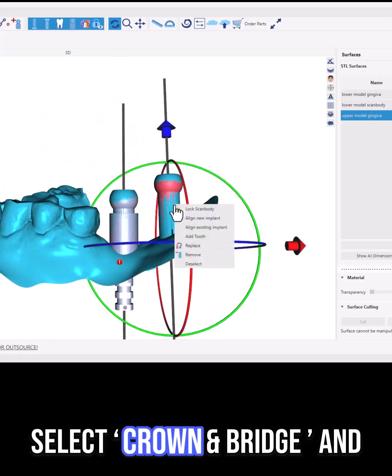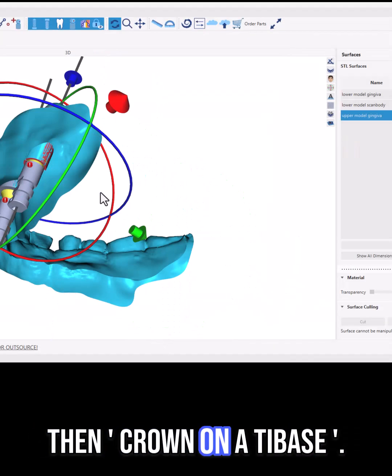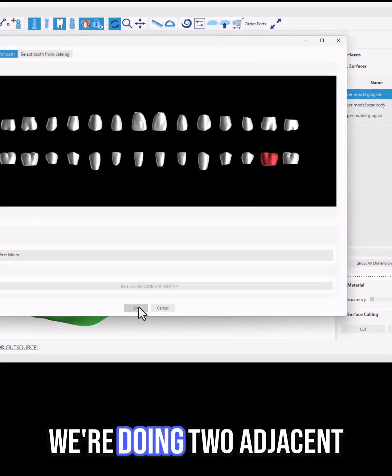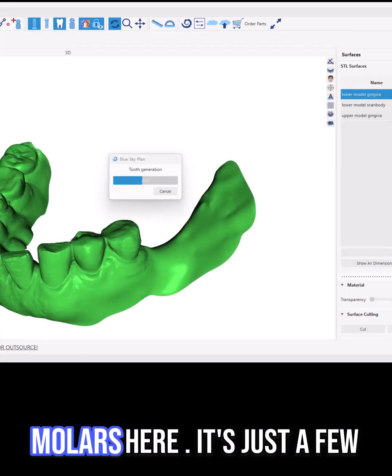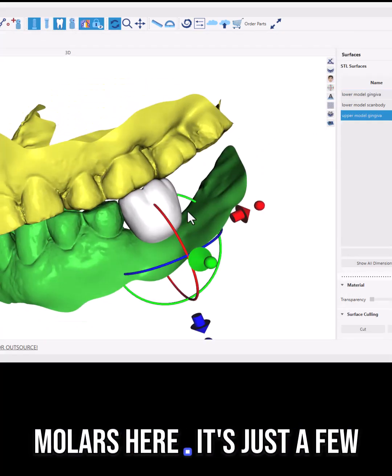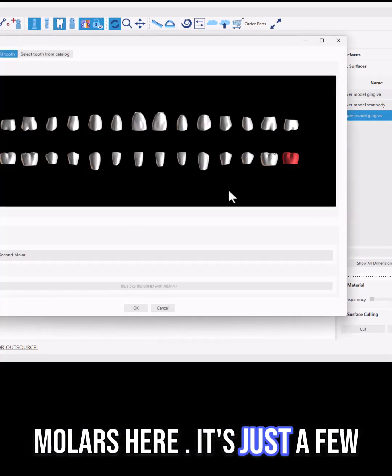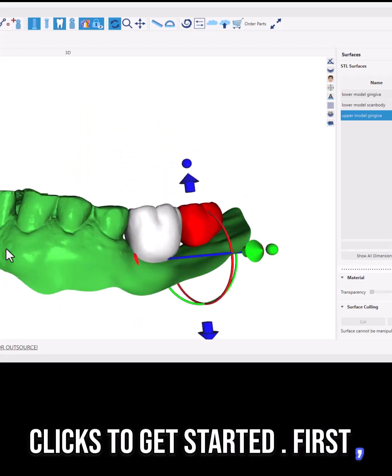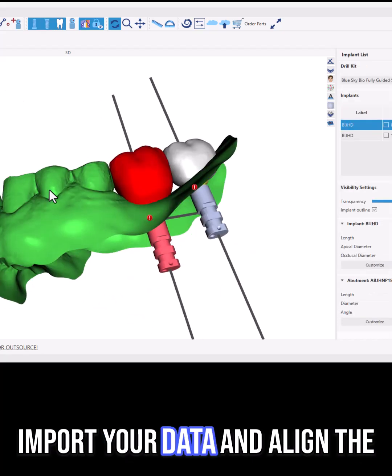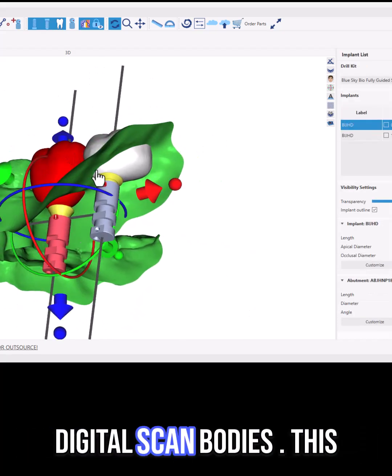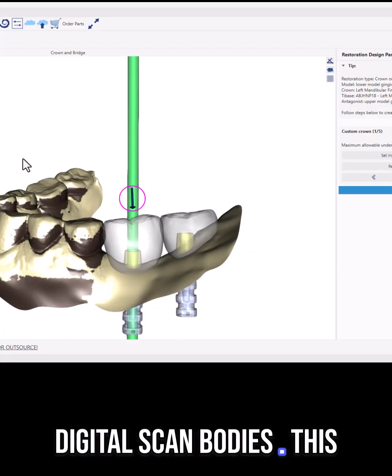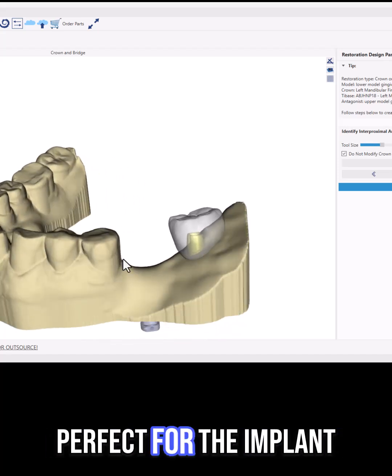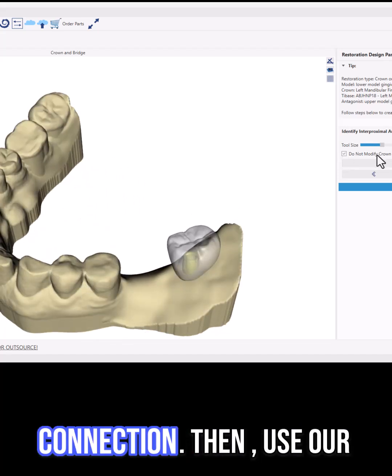Select crown and bridge, and then crown on a tie base. We're doing two adjacent molars here — it's just a few clicks to get started. First, import your data and align the digital scan bodies. This ensures your geometry is perfect for the implant connection.